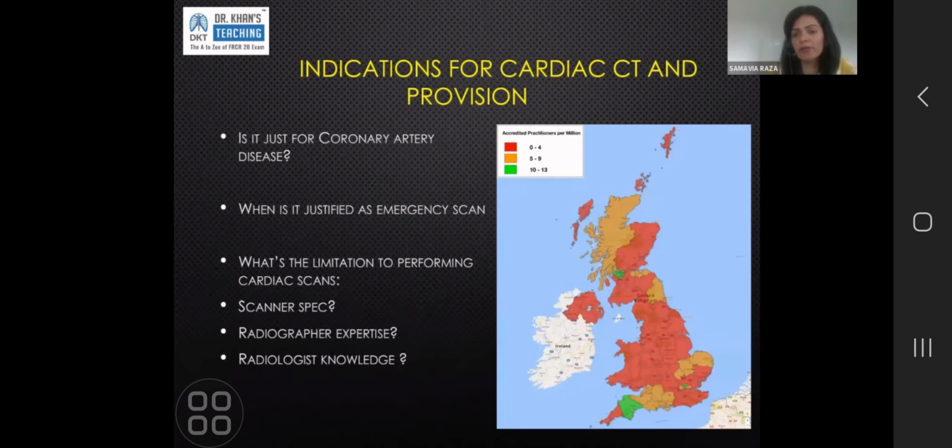They do a lot. They do on calls, they do trauma, they do different sorts of scan. Different centers, some centers have a dedicated set that only those radiographers will do cardiac imaging. Very few centers have almost all radiographers trained up in cardiac CT, and we are one of them. So radiographer expertise, yes, definitely. It comes down to the person scanning and the person reporting. Scanner spec is not a huge issue in the UK.